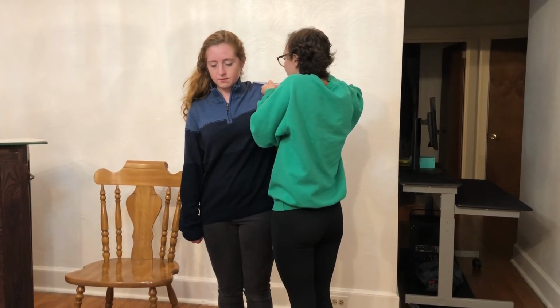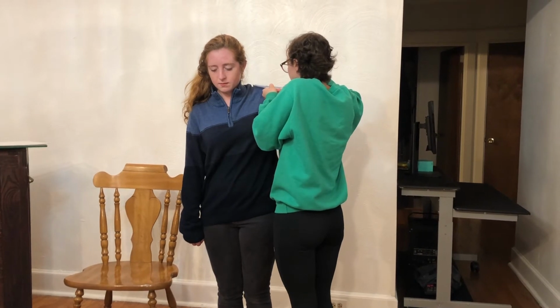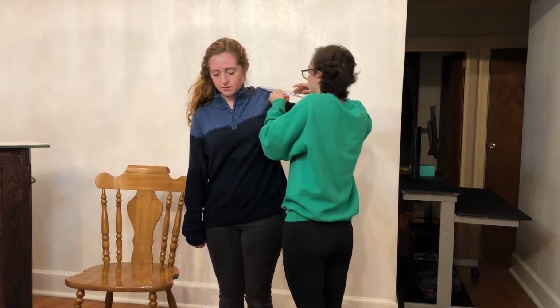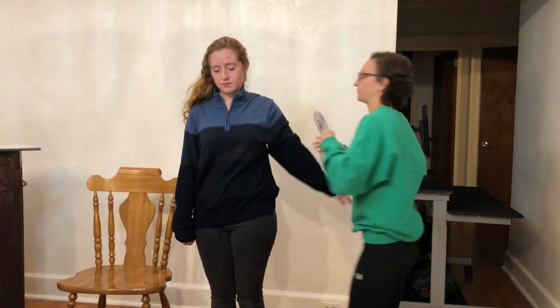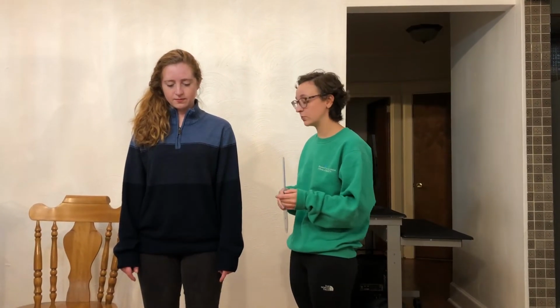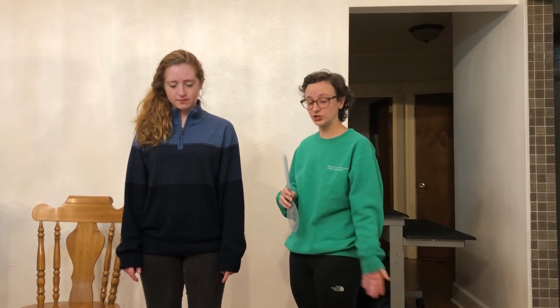Okay, and my patient is reaching 44 degrees of horizontal abduction. And this is goniometry of the shoulder. Now I'm going to do range of motion measurements with the goniometer for the elbow. So for the elbow, we have extension and flexion.